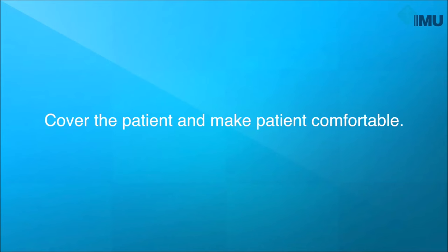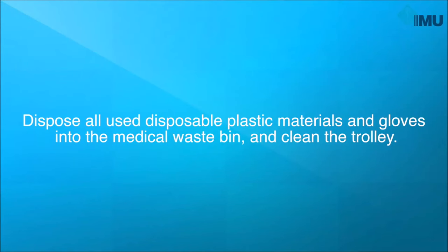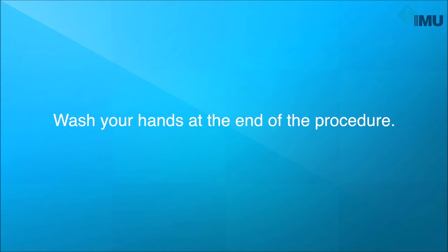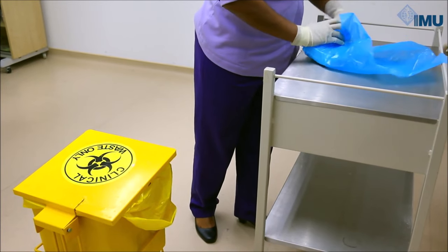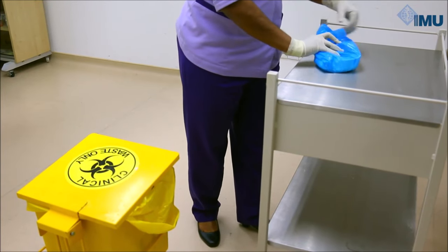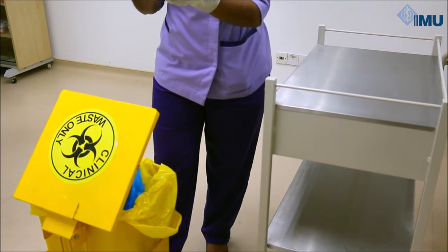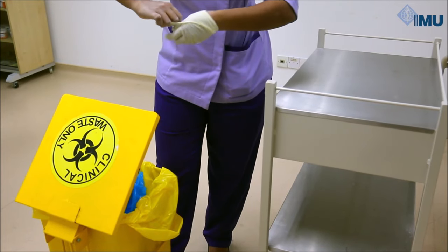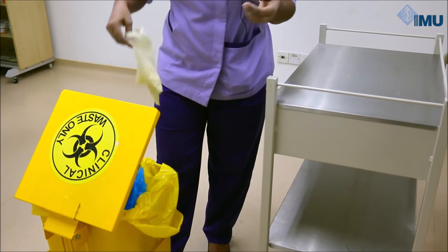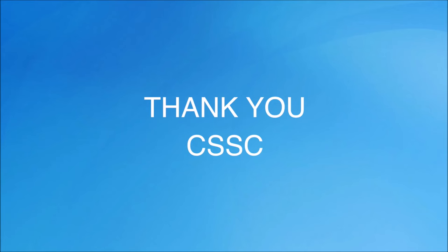Connect the urinary drainage bag to the hanger and hang it under the bed. Cover the patient and make the patient comfortable. Dispose all used materials and gloves into the medical waste bin and clean the trolley. Wash your hands at the end of the procedure. Thank you, Mrs. Jane.